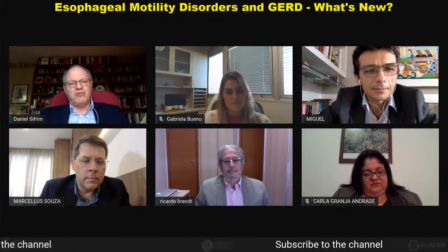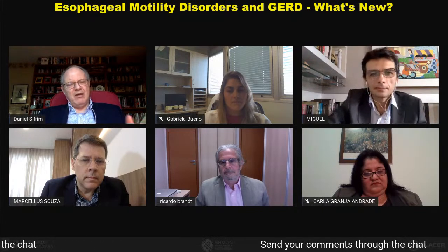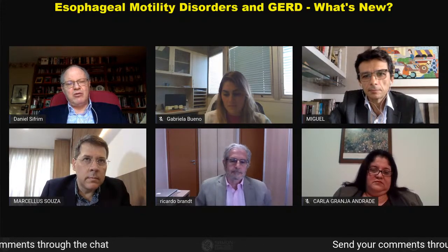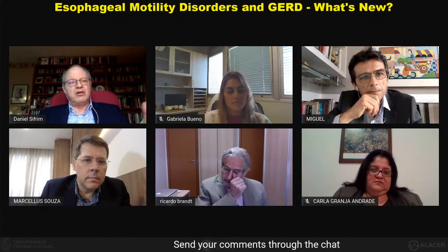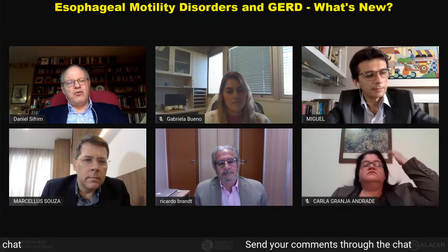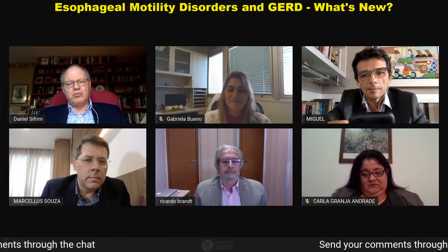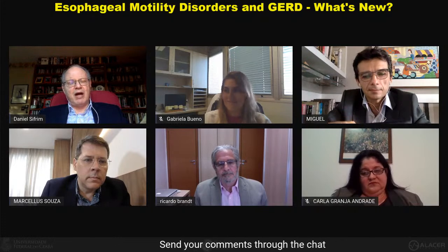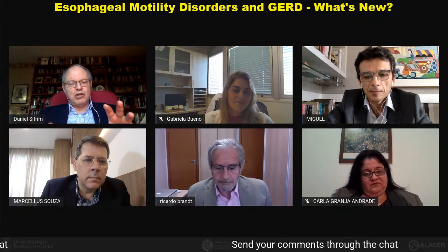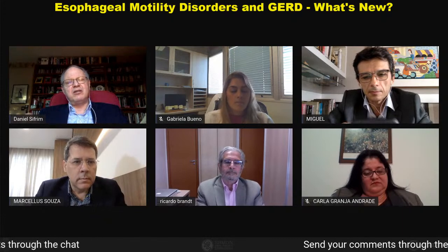So I think that in patients where the symptoms are much more intermittent, not every day, and the symptoms are very typical, heartburn or chest pain, I will not be against the use of wireless pH metry for 72 hours or even 96 hours. But in patients where the symptoms are more atypical, are more frequent, are related to a little bit of belching or respiratory disorders, I think that a good 24 hours impedance pH metry will do the job. The two techniques are not competing with each other theoretically. One has an indication and the other has other indications.